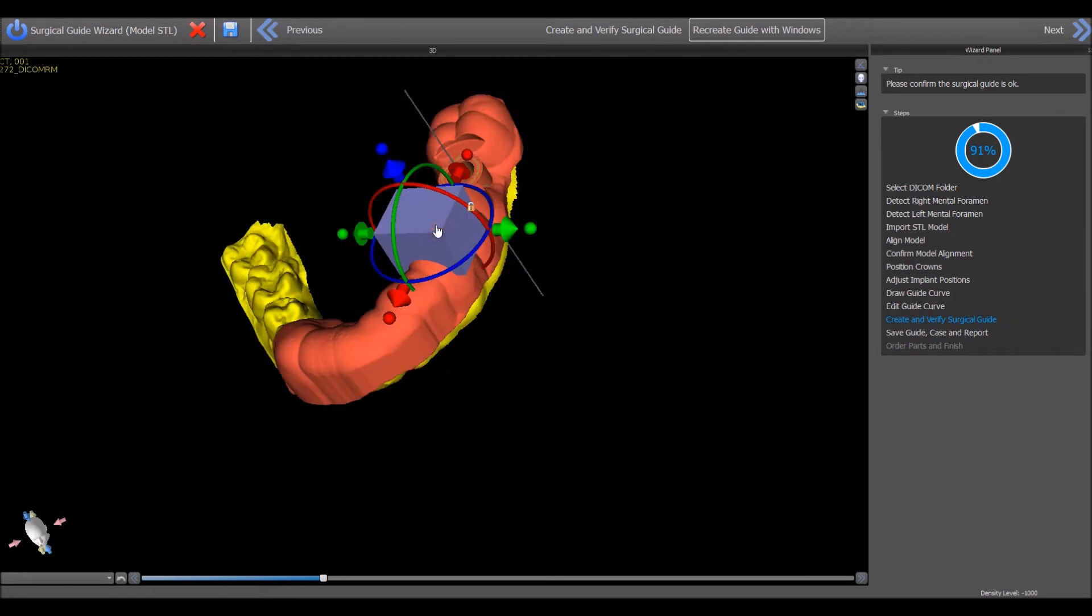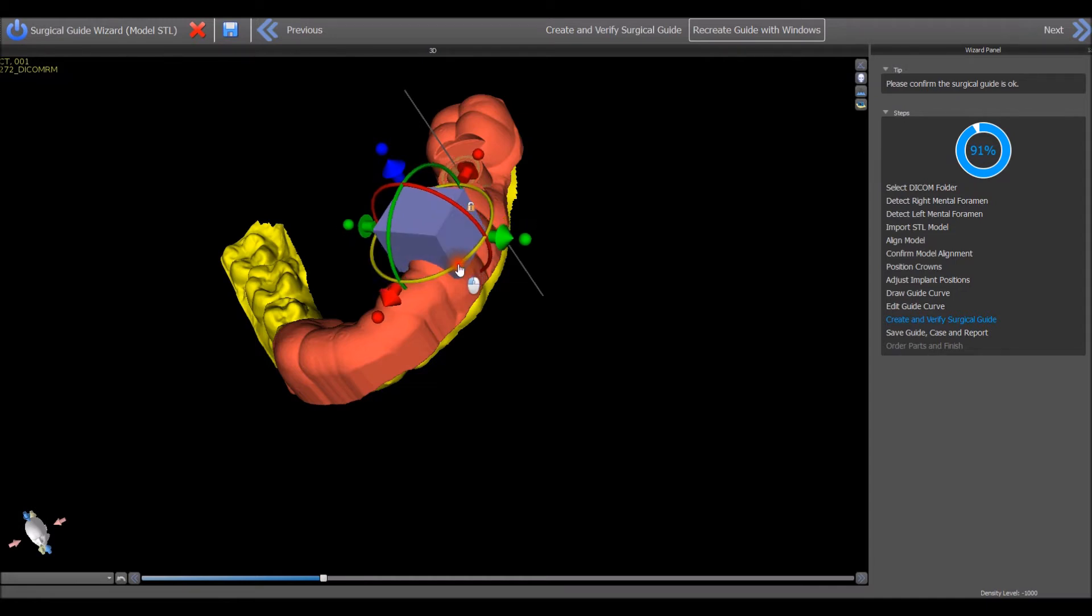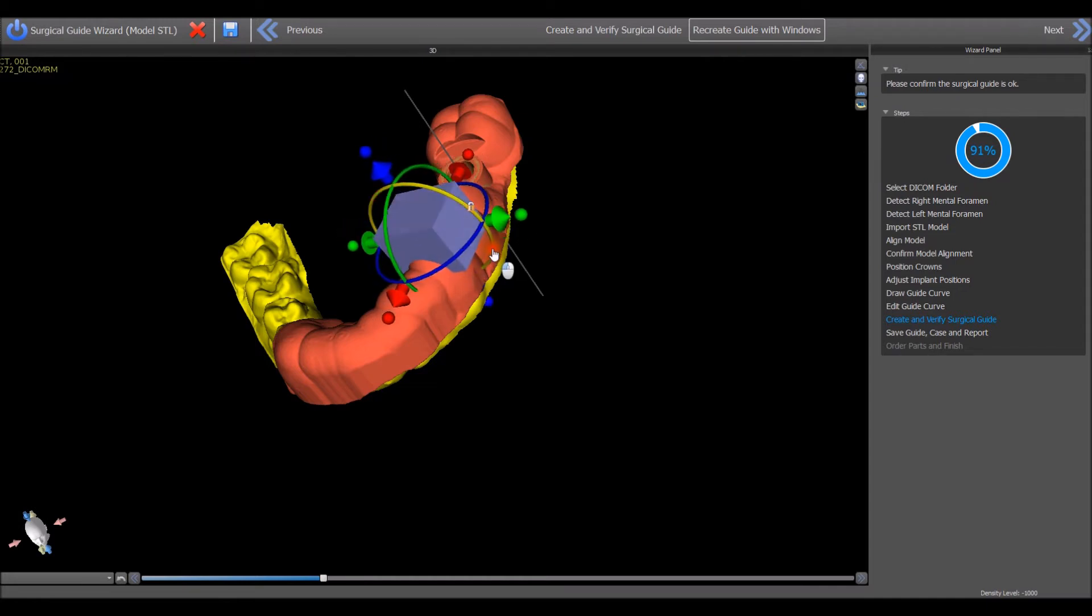Use your left mouse button to grab and drag the red, green or blue circles surrounding the block to rotate the block.